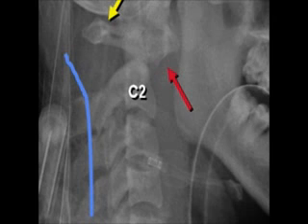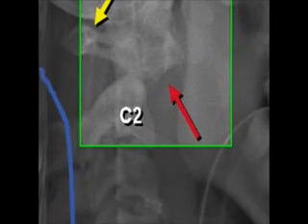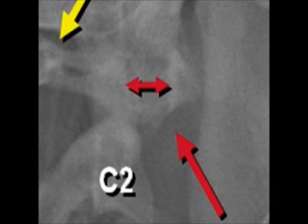You can see that the body of C1, as indicated by the yellow and red arrows, is markedly forward on the body of C2. The blue line, which is supposed to smoothly connect all the spinal laminar white lines, clearly misses posteriorly the spinal laminar white line of C1, indicated by the yellow arrow. There is a marked increase in the predentate space — in the actual radiograph this measured 15 millimeters.